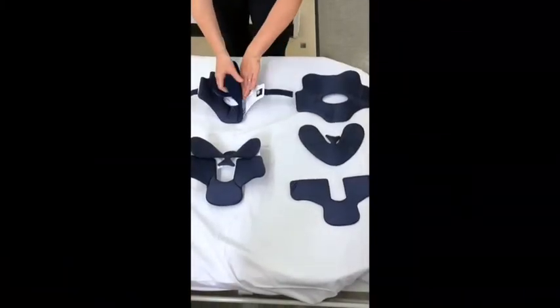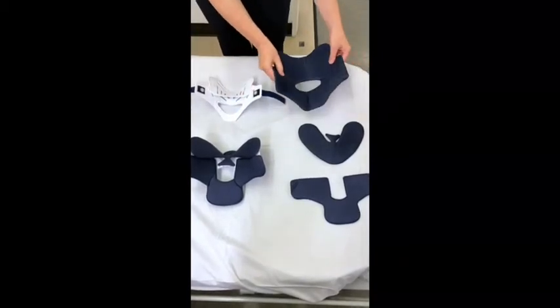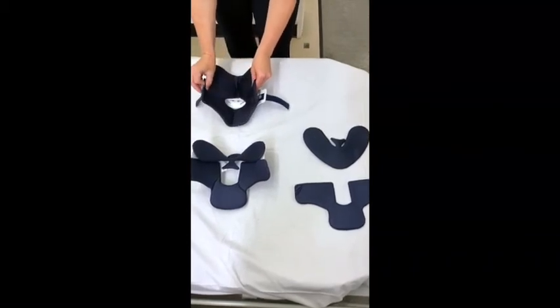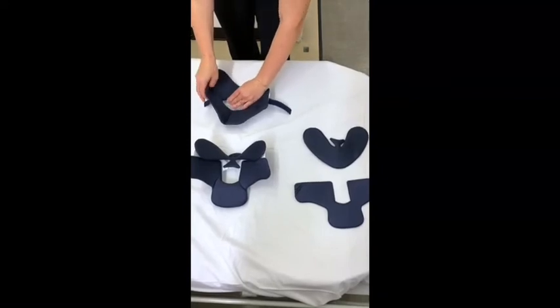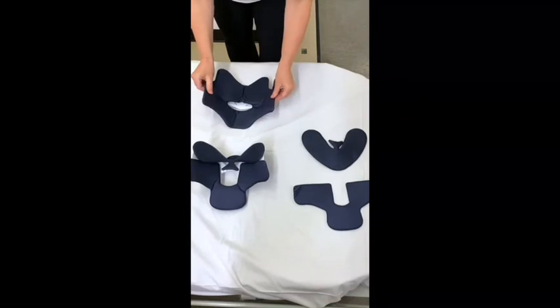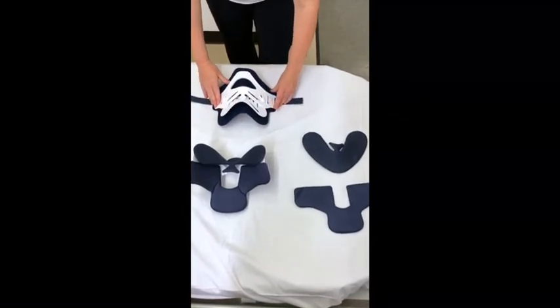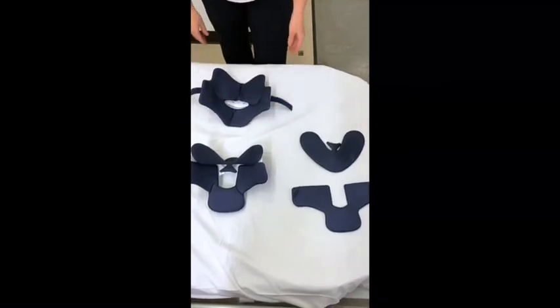The collar will come with spare pads. This is so the used pads can be removed and the second clean set applied. The pads should be changed and washed every day. It is easier to remove the pads one at a time and replace with the appropriate shaped clean pad as you go along. Adjust the pads as needed to make sure no plastic touches the skin. Once removed, the pads should be hand washed in warm soapy water and left to air dry. Ensure that they are completely dry before reapplying.